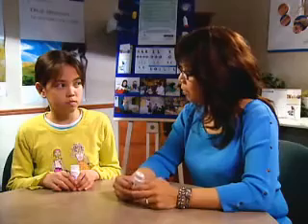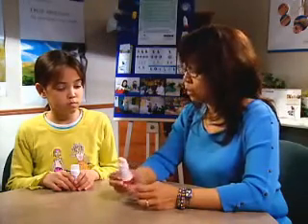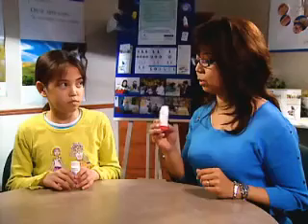For children using a turbuhaler, proper administration techniques should be consistently reinforced. They should be reminded often that turning the device upside down, shaking it, or dropping it will cause the medication to be lost. Blowing into it will dampen the dry medication, and this should be avoided.